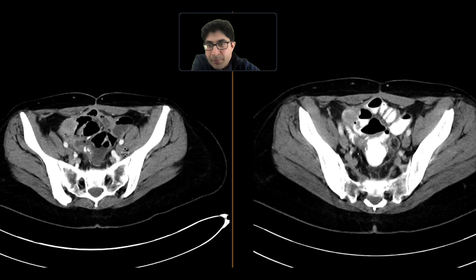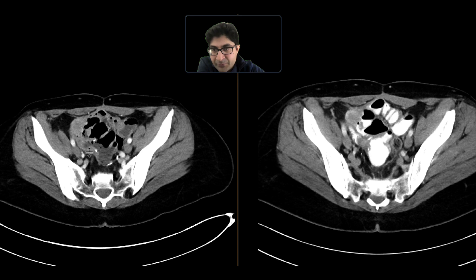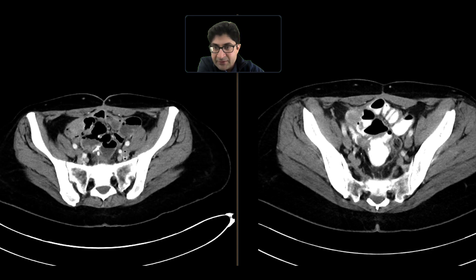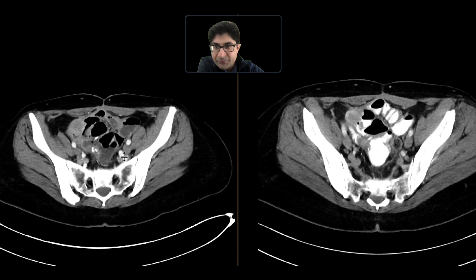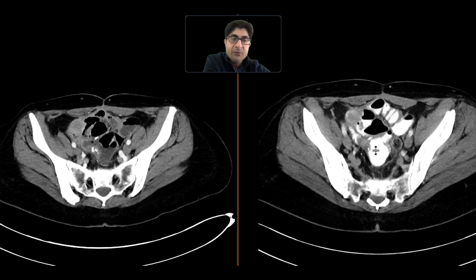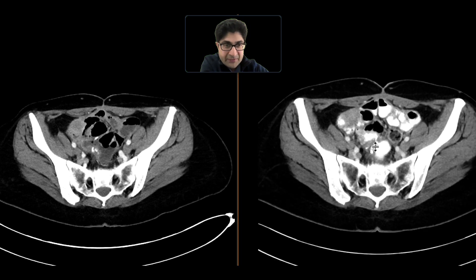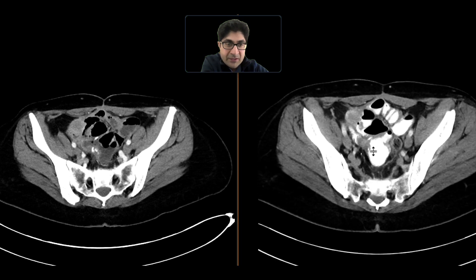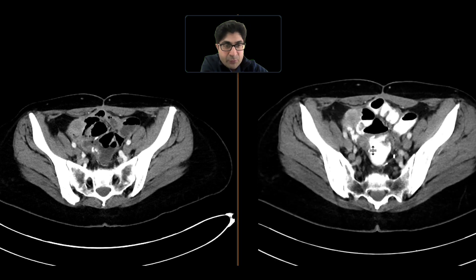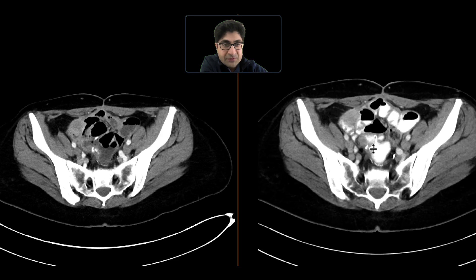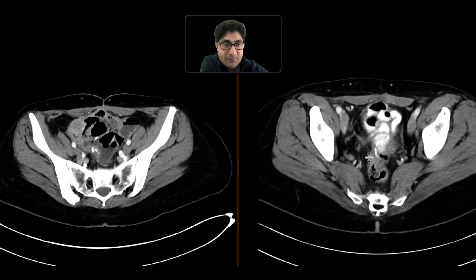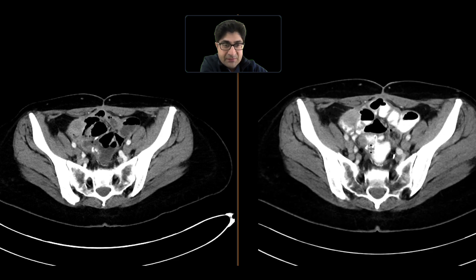Going back, all these findings were there on the prior study, much more difficult to detect due to the lack of oral contrast. But now that we've given oral contrast, we can see that this finding is more apparent. We've certainly moved away from giving oral contrast for a lot of our patients, but it can be useful, as we've seen in this instance.